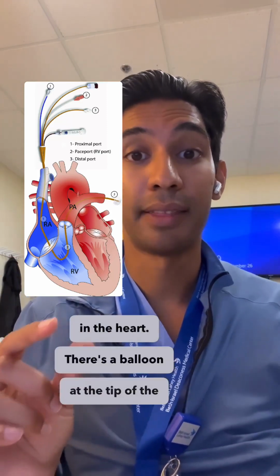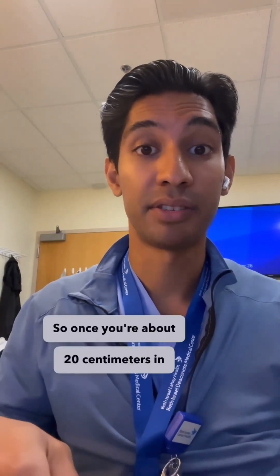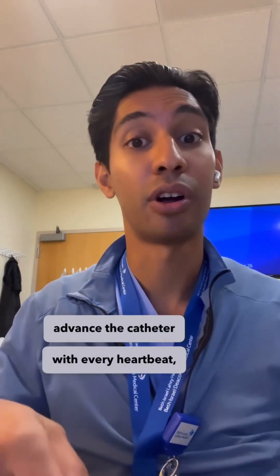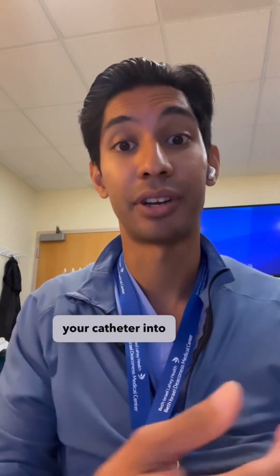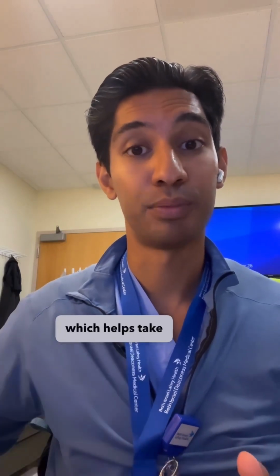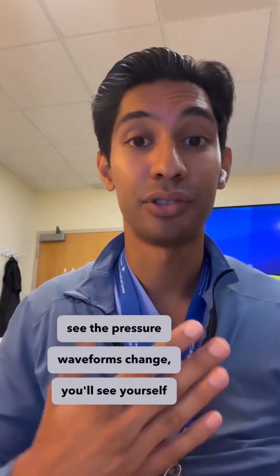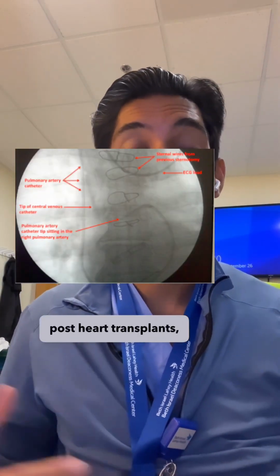Now, there's a balloon at the tip of the catheter that basically helps float it into the PA. So once you're about 20 centimeters in and you're confident that you're in the RA, you'll have someone inflate the balloon for you. And then you typically advance the catheter with every heartbeat, hoping that the stroke volume of the right side will basically guide your catheter into the RV. There's also the natural curvature of the catheter itself, which helps take that curve around the outflow tract. And then eventually, as you see it get advanced and you see the pressure waveforms change, you'll see yourself get into the pulmonary artery.